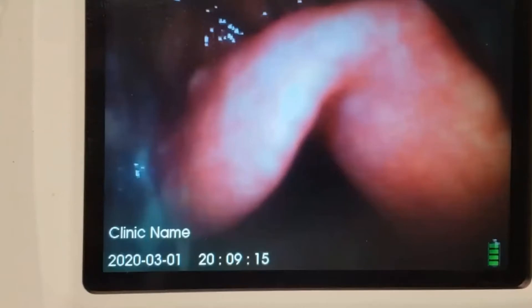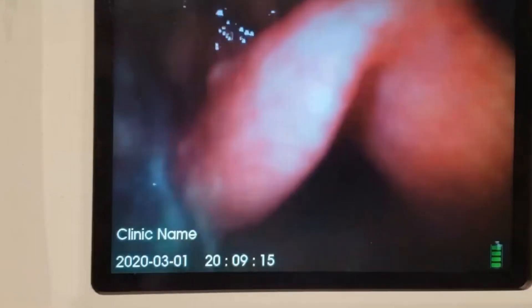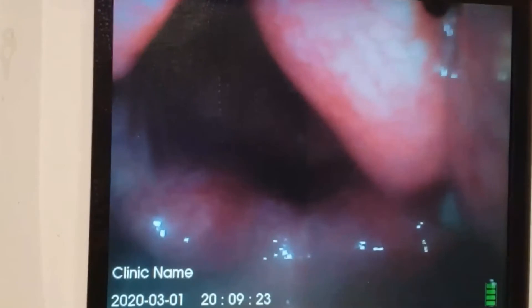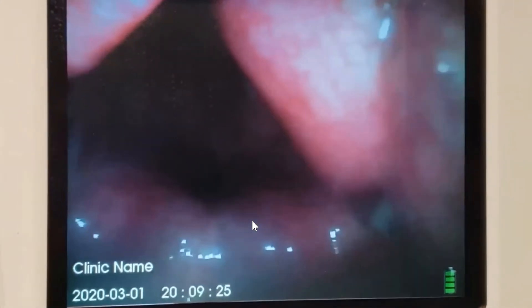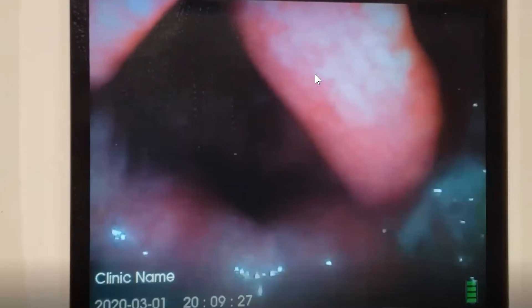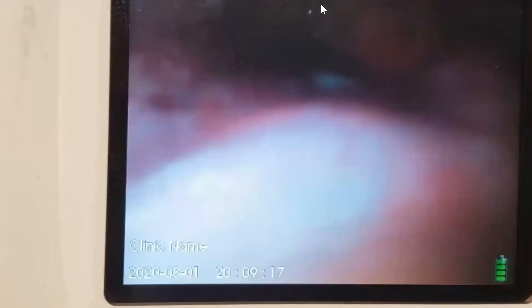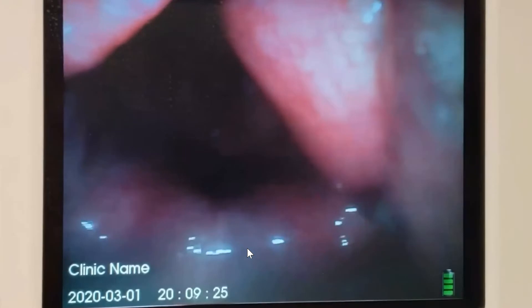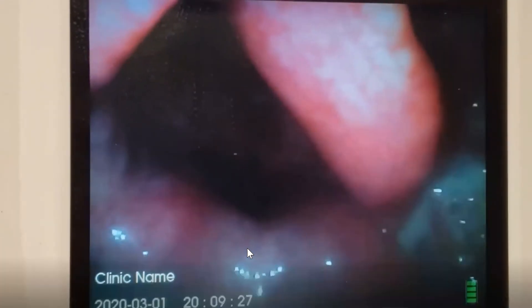In this carve-out, I want to point out something subtle for beginners. Notice that as I try to go into the vallecula — I go in and pull up — I appear to be pretty distant from the glottic opening. Something just didn't seem right. What happened here is that someone gave me a size three blade for a gentleman instead of a size four. It was just too small, so I couldn't get the tip far enough down to get a clear view. That's why it looks dark. Let's look at the difference between the size three and size four blades.